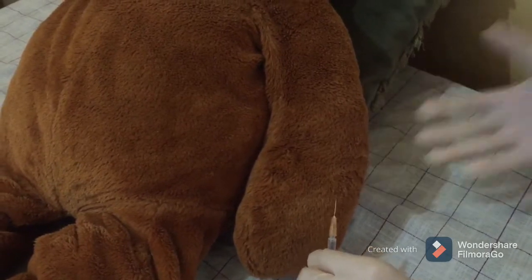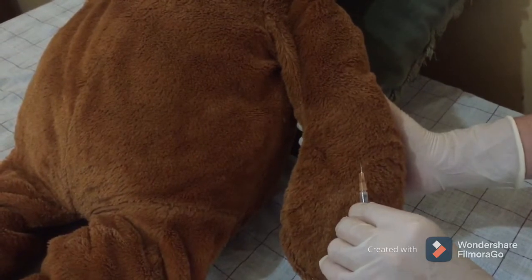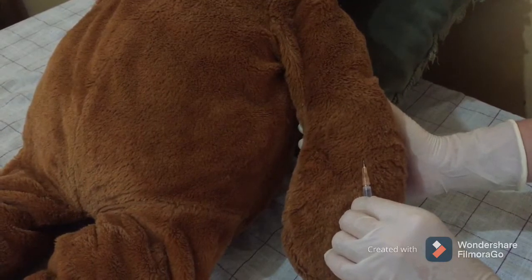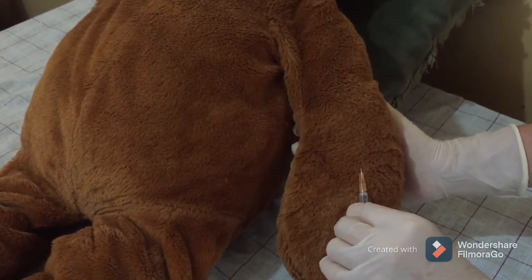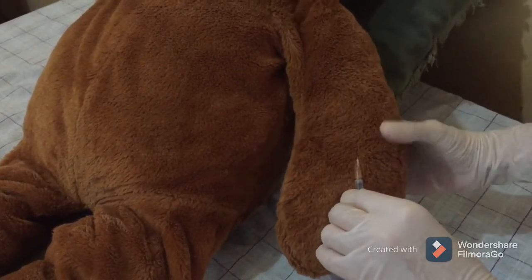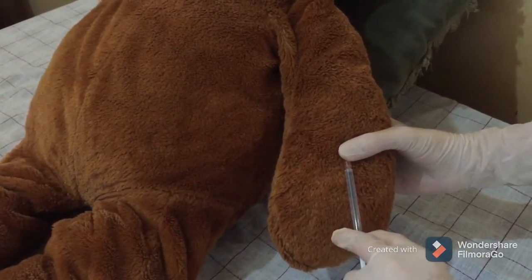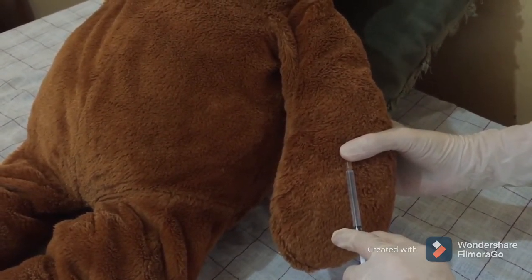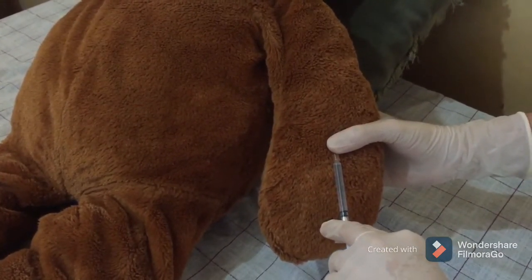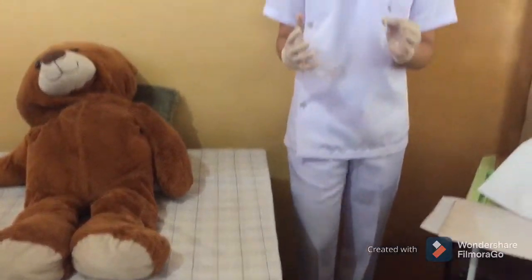With the non-dominant hand, pull the skin at the site until taut to allow easy entry of the needle. Then we insert the tip of the needle far enough to place the bevel through the epidermis into the dermis. The outline of the bevel should be visible on the skin surface. Then we stabilize the syringe and needle and inject the medication carefully and slowly so that it produces a small wheal on the skin. Then we withdraw the needle quickly at the same angle at which it was inserted. Take note, we should not massage the area.